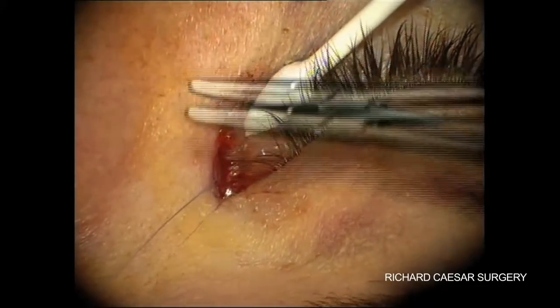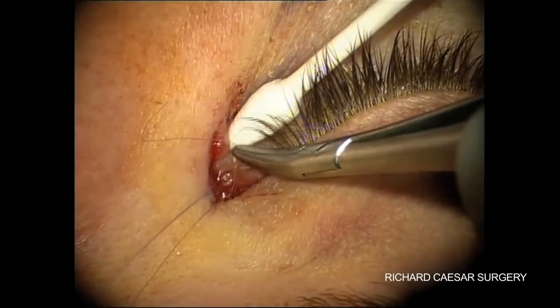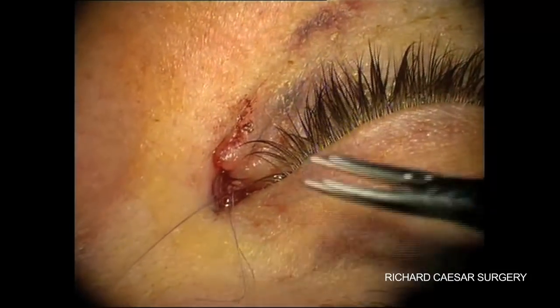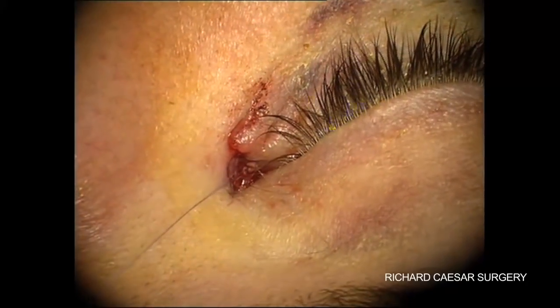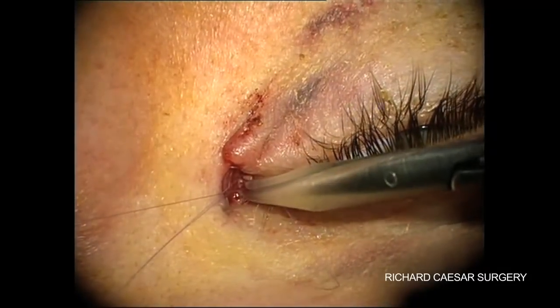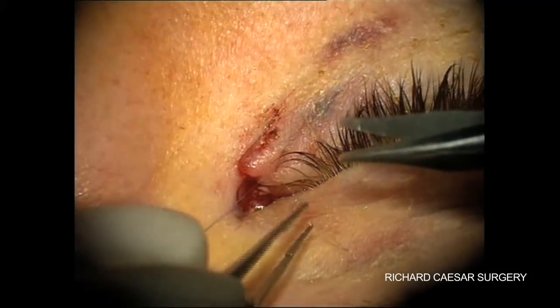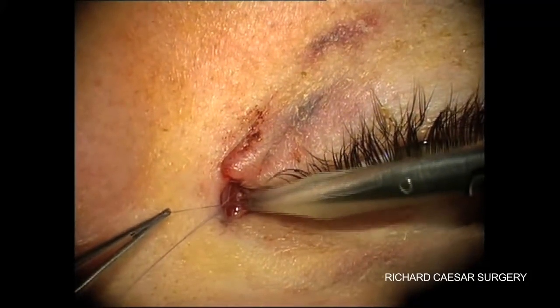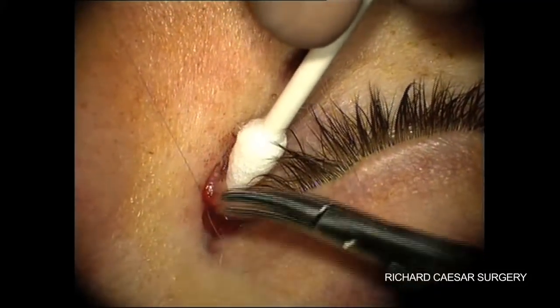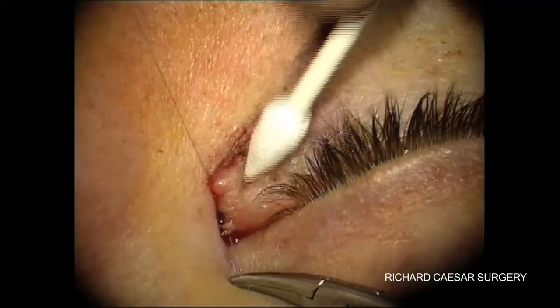In order to help slide the edges together, you can see here how my assistant is pushing on the lower lid using the tip of a cotton bud. This basically extends the reach of their finger and without getting in the way of the operating microscope, so you can maintain a good view. And this is repeated for the first 8-0 vicryl.